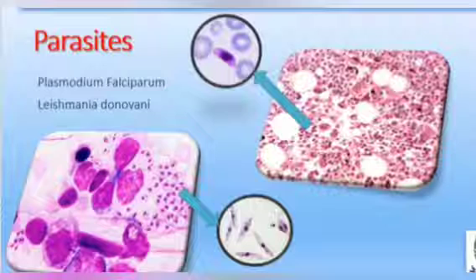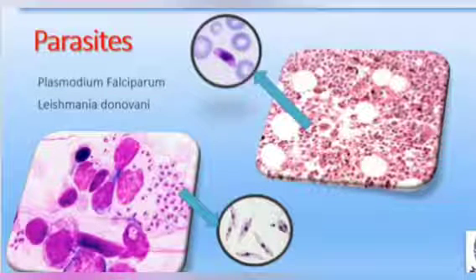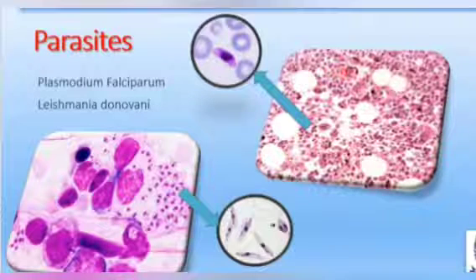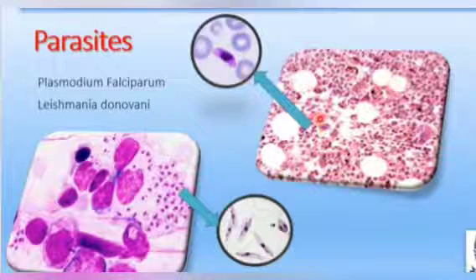You are also examining for the presence of parasites, particularly Plasmodium falciparum. This is a bone marrow smear, and here you are looking at its zoom.